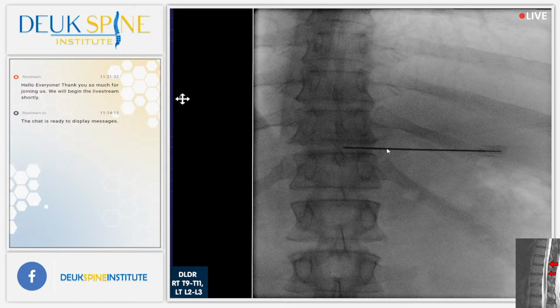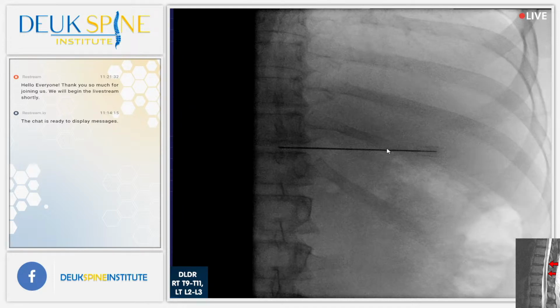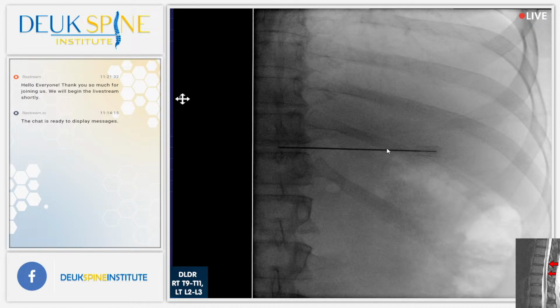You want to see the edge of the ribs. There you go. Further. Yeah, it looks good. There's no evidence of pneumothorax. Yep. You can see the lung markings, vascular markings going all the way. All right, so we've got 2 needles placed out of 3. We got 1 more to go.